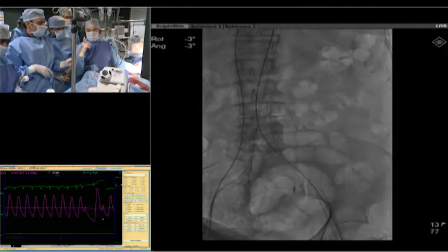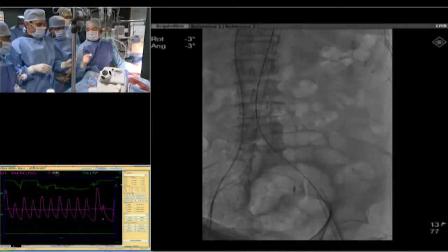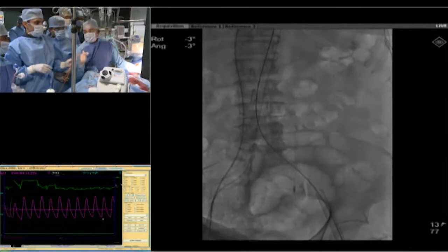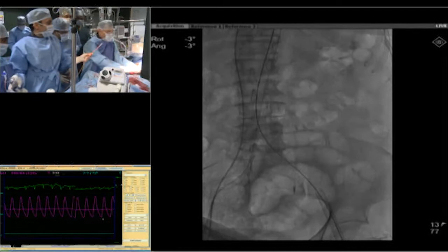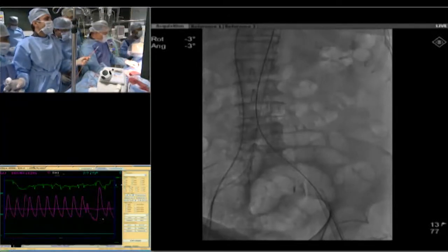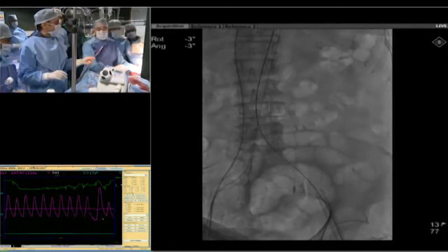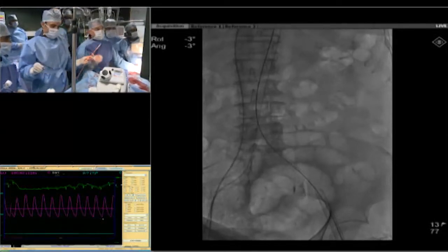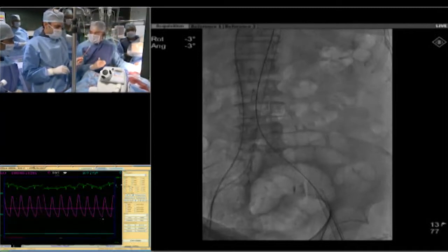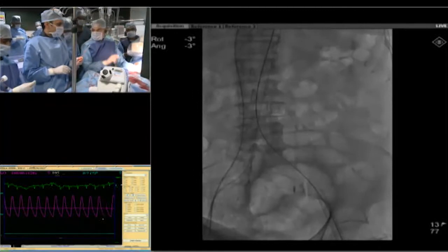After the valve is deployed, we'll deflate the balloon. Mind you, pacing will continue. Once the balloon is deflated completely, then we will say stop pacing. It's very important, don't stop pacing. If there is any loss of pacing in between, Patil, Vijay, you have to make sure that the wire goes in. What happens sometimes is that when the patient drops the pressure, there is a movement of the patient. So you need to make sure the legs don't move, otherwise things get pulled out, right?